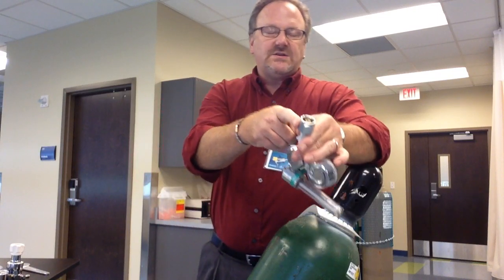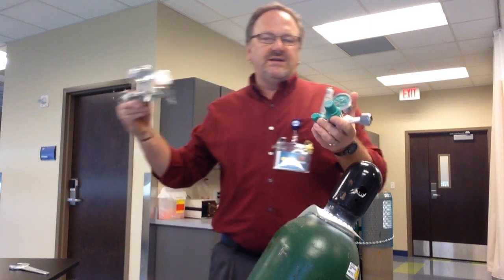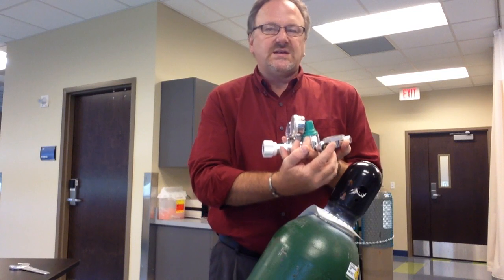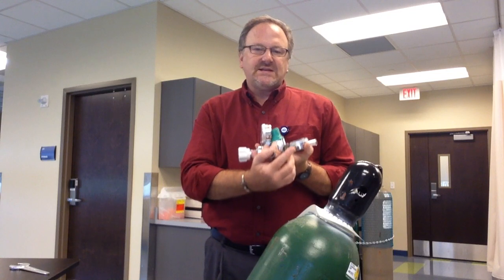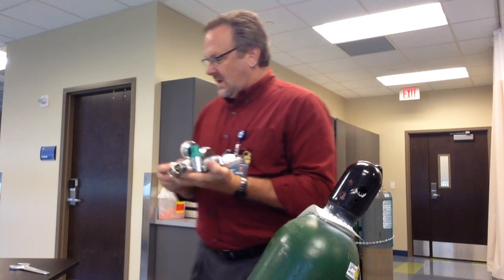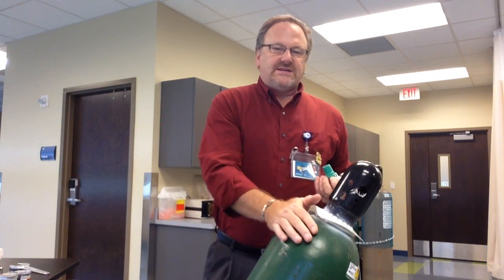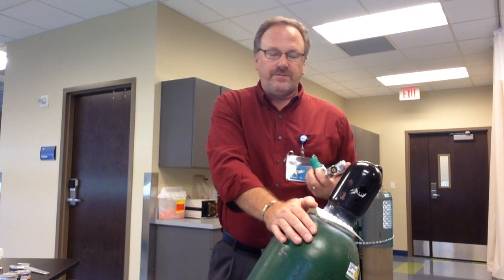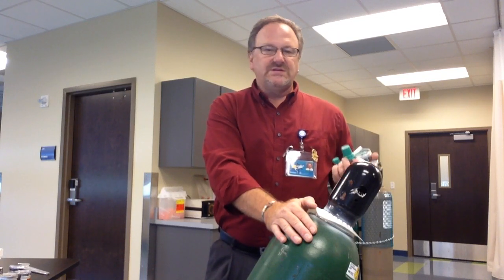Oxygen nuts are all the same size. Both of these utilize a safety mechanism — these are a certain size. That is the American Safety Standard System, ASSS. The American Safety Standard System is utilized on pressures greater than 200 PSI. The tank has a PSI of anywhere from 2,000 to 2,200 when it's brand new, so it has to use the American Safety Standard System.